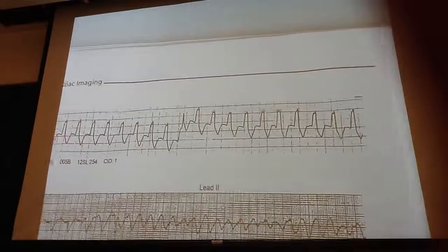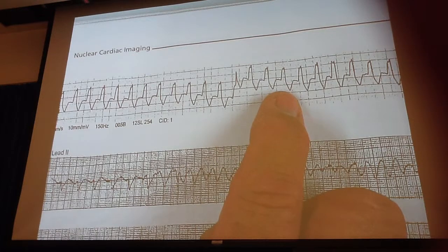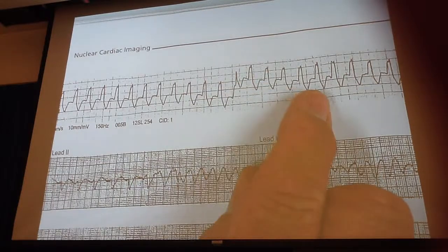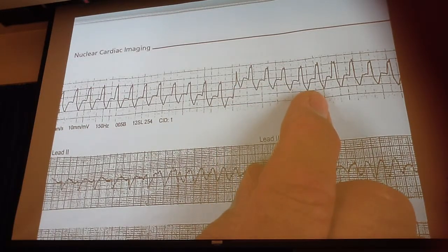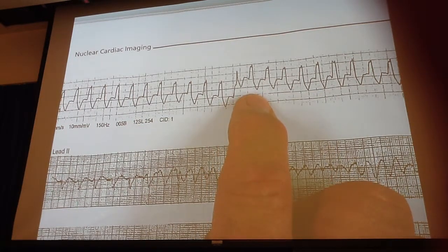Okay, now, the reason we're getting into some other things here, what is this one up here, guys? Is that an AFib or ventricular tachycardia? It's important, okay, you're doing a patient, and all of a sudden you start seeing an EKG pattern like this. VTAC. Okay, this is VTAC, ventricular tachycardia.